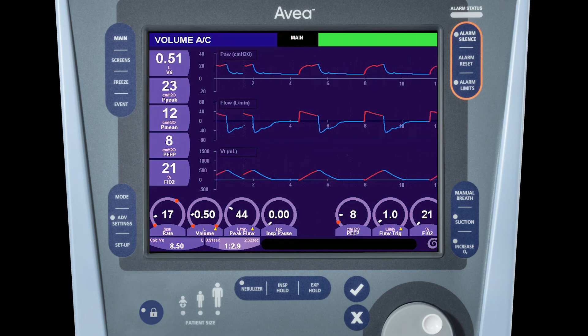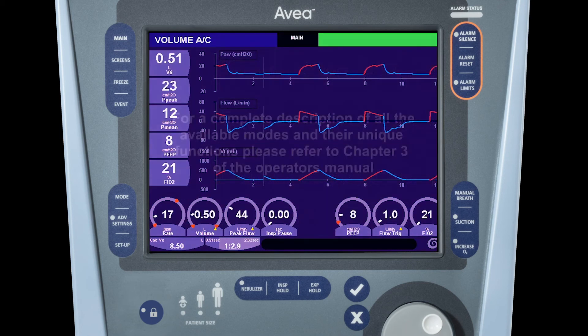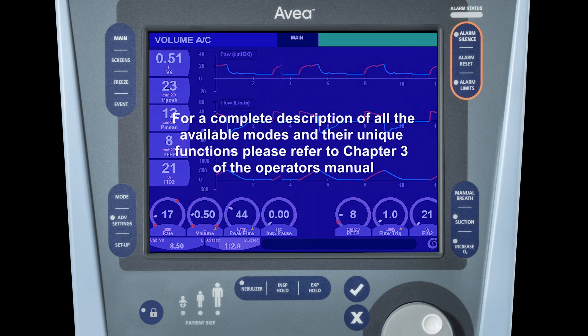For a complete description of all the available modes and their unique functions, please refer to chapter three of the operator's manual.